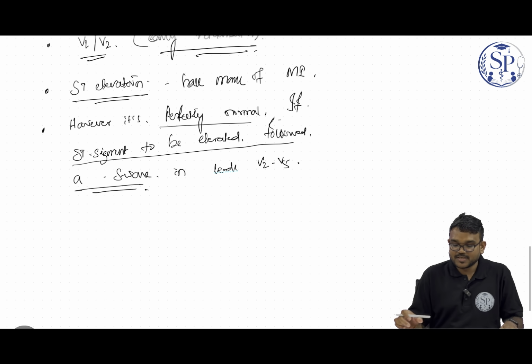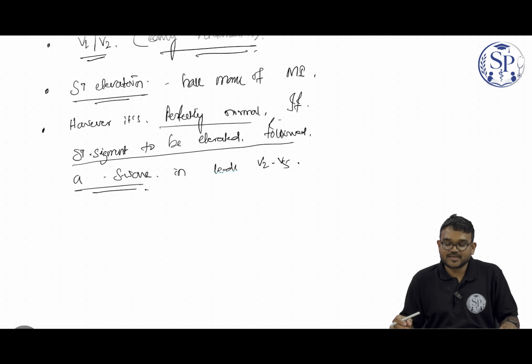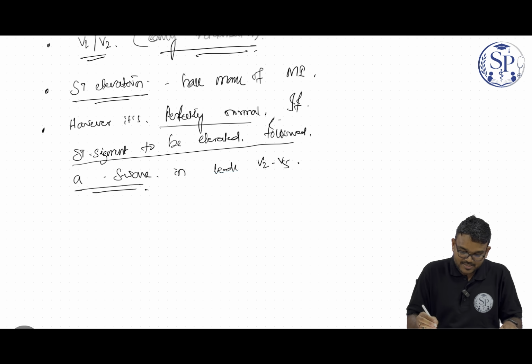If the ST segment is elevated and followed by an S wave, it is called a high takeoff ST segment.